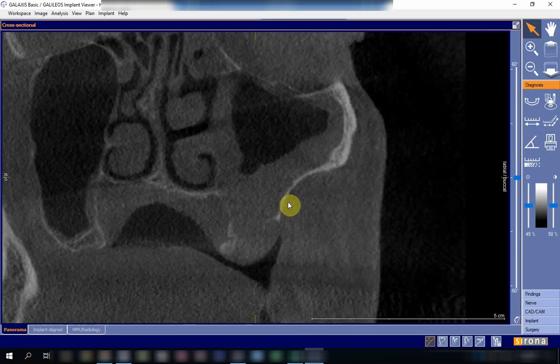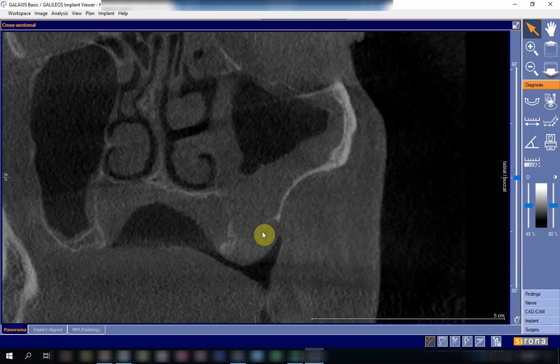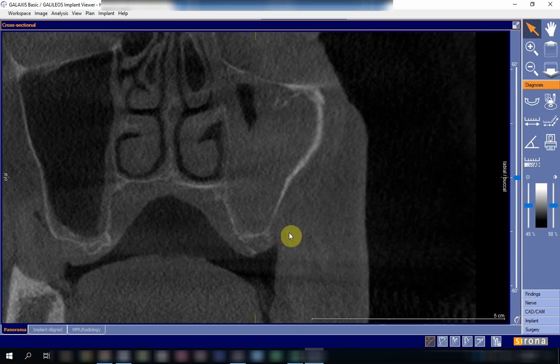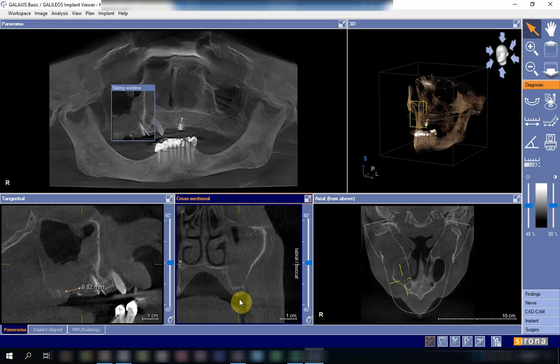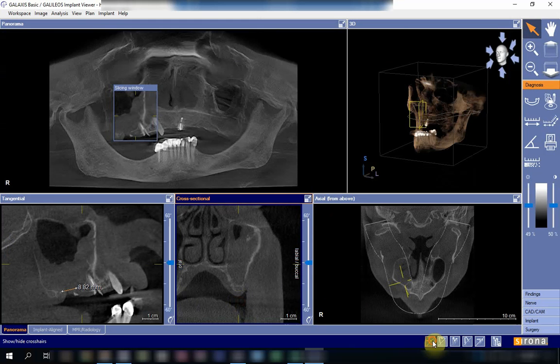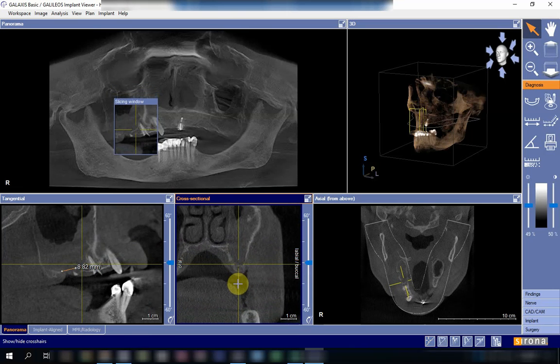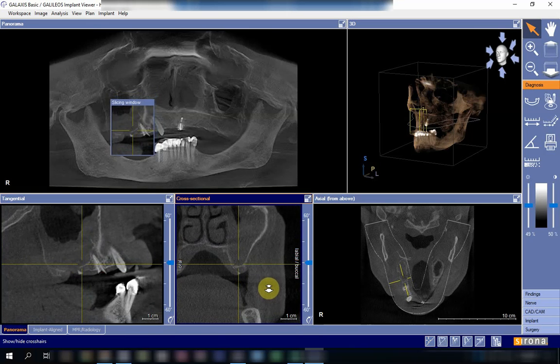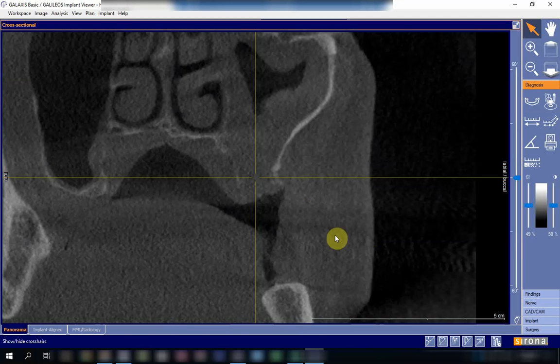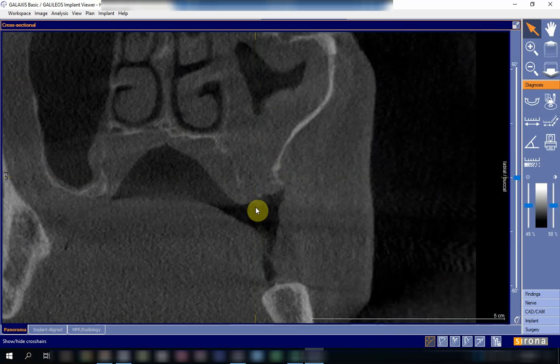In the coronal view, this is the floor of the sinus and this is the buccal facial wall of the sinus. There should be a floor of the sinus here but it is absent. Going more anteriorly to the premolar region, the floor of the sinus is present with no discontinuity. But going posteriorly, there is no more floor of the sinus in this area, which confirms the oro-antral communication.